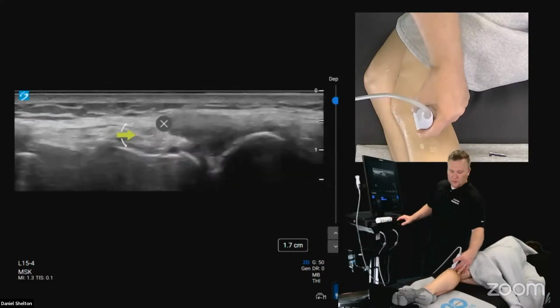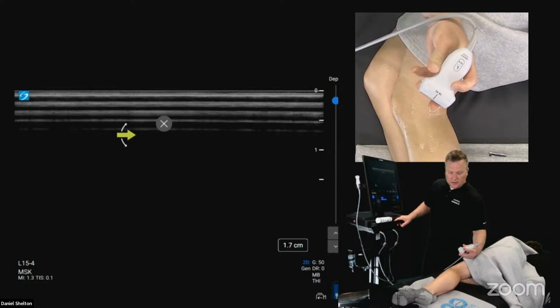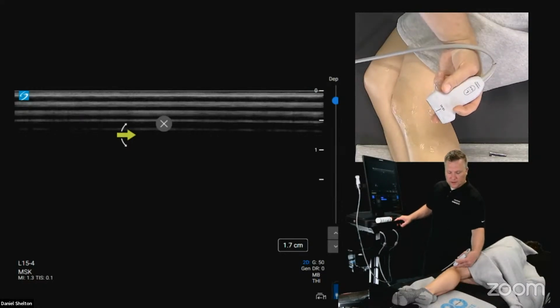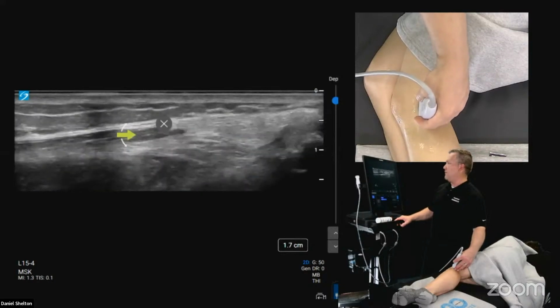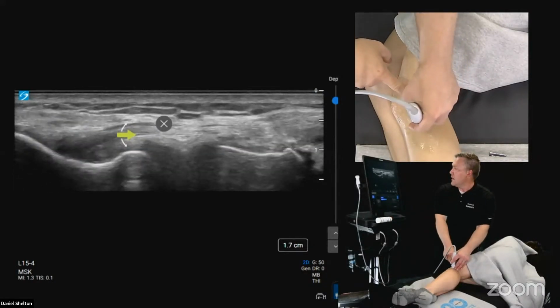So I'm just doing all this by palpating. If it looks like I'm doing it really fast, one, I am doing it a little fast. Two, just poke your finger under there and palpate. Use that fibula to windshield wiper off of. And if you also take your other finger and palpate the lateral epicondyle.